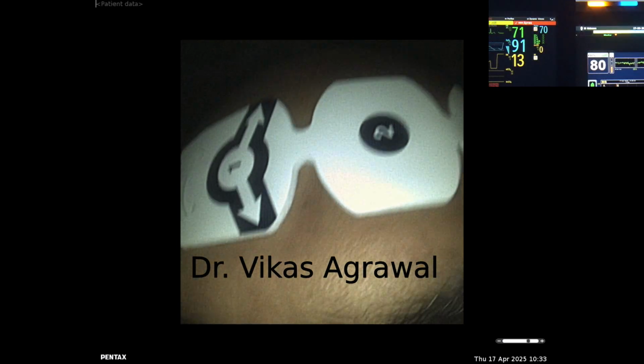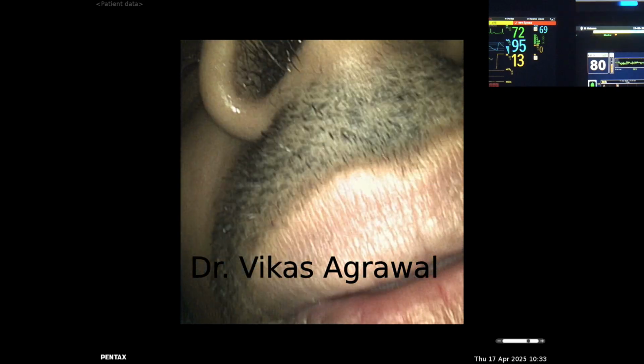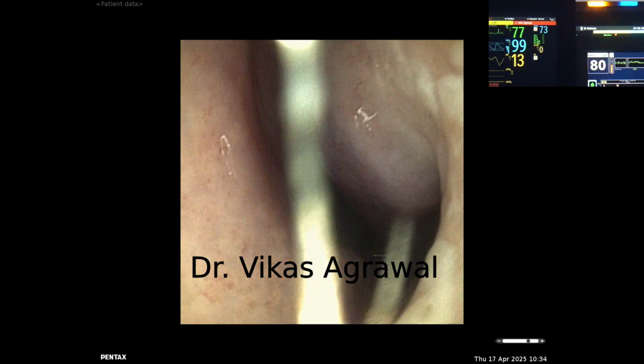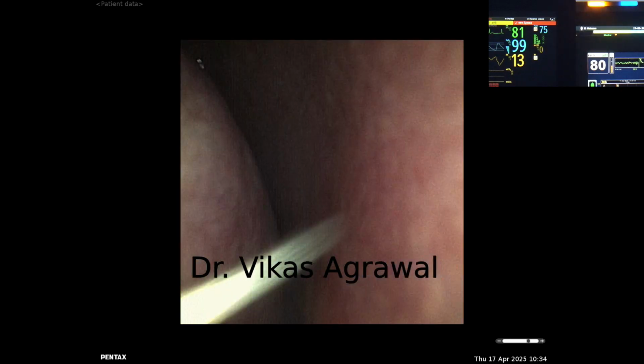So here you're watching the Induced Sleep Endoscopy with this monitoring. In a 37-year-old male with history of snoring, choking, you can see he's breathing through his mouth partly. He's got a deviated septum on the left and turbinate hypertrophy. More than the deviated septum, turbinate hypertrophy is prominent on both the sides.